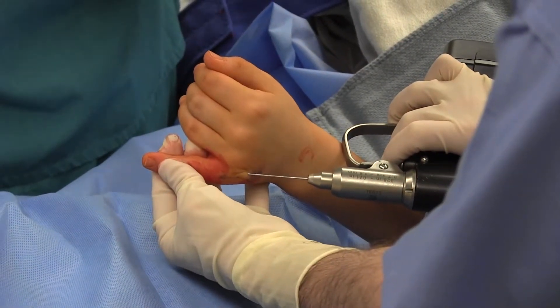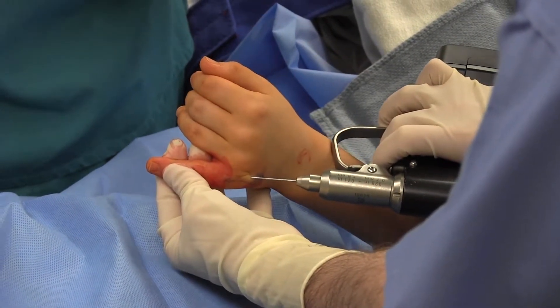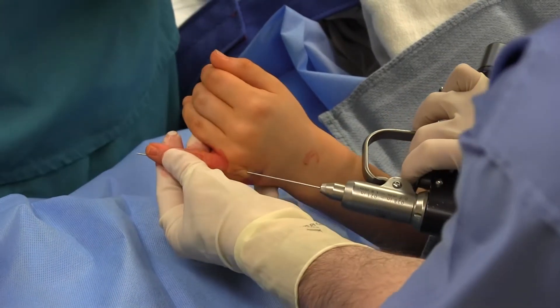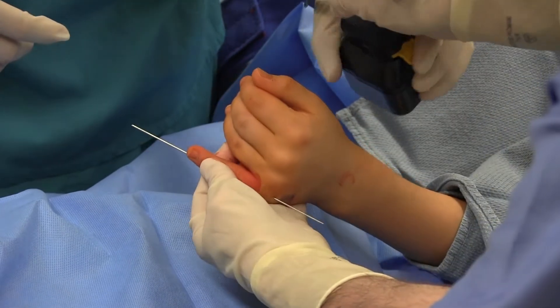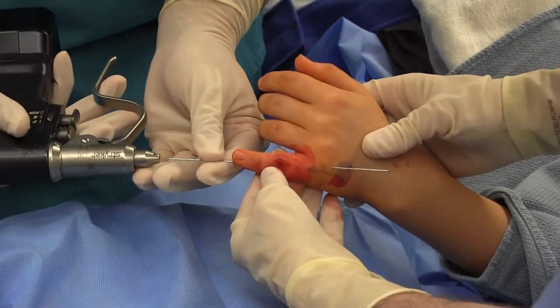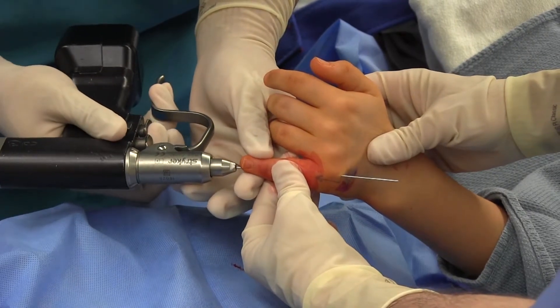Here, the k-wire is passed directly down the small finger into a percutaneous position. The k-wire is then withdrawn until the wire is within the proximal phalanx and not the metacarpophalangeal joint.